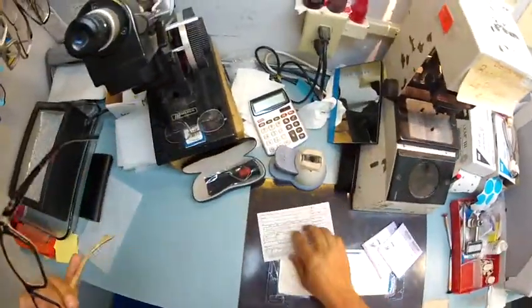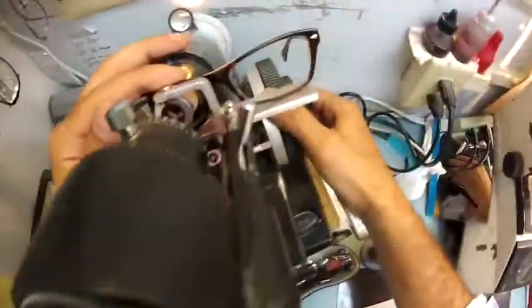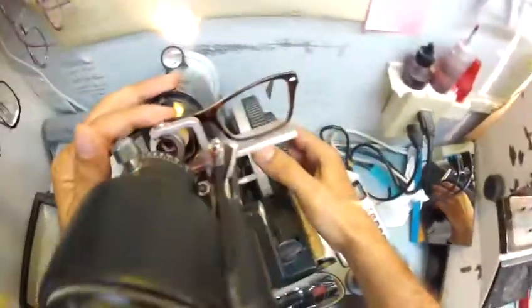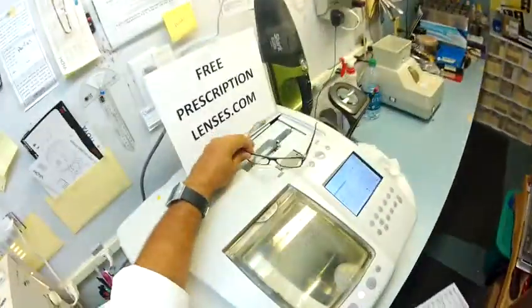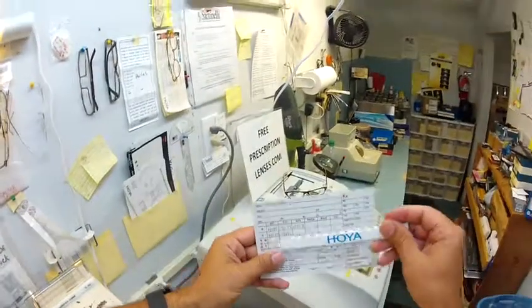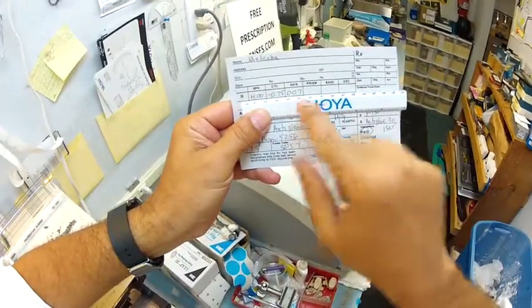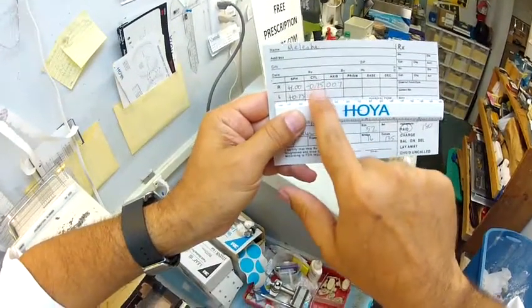I'm going to leave that on there for now to measure something in the future, but I'm going to put it in the wheel. Of course I never moved it, it's still on 7. And I'm reading +1. Hopefully you can see that. Check your astigmatism correction. And we're at +1/4. So your prescription reads, your right eye is +1 -75 at 007. Your left eye is a +75 sphere, meaning you have no astigmatism.